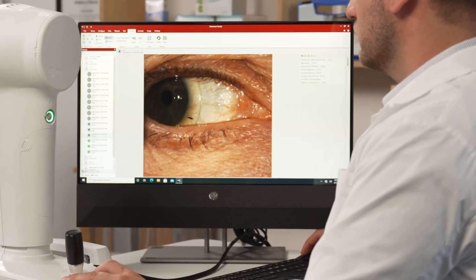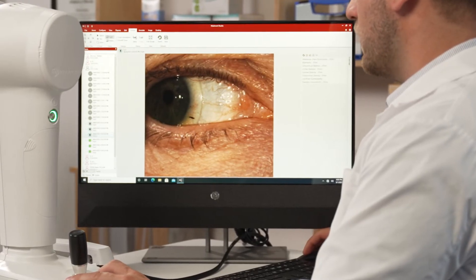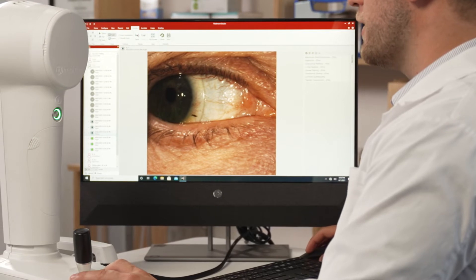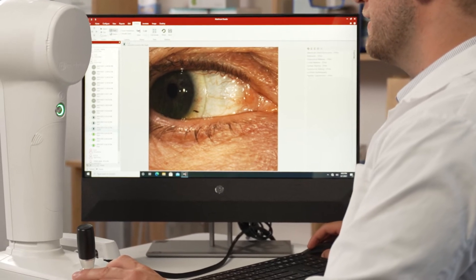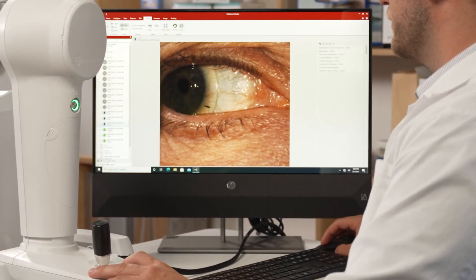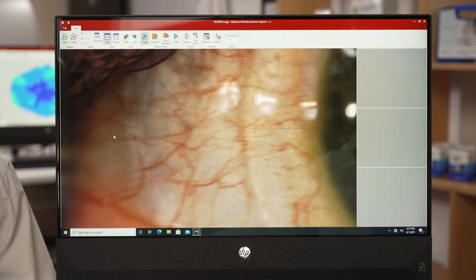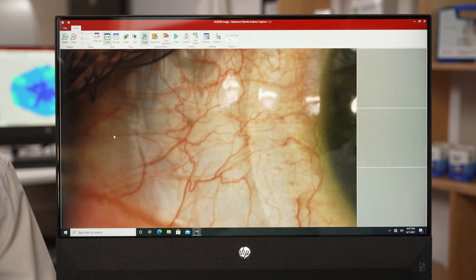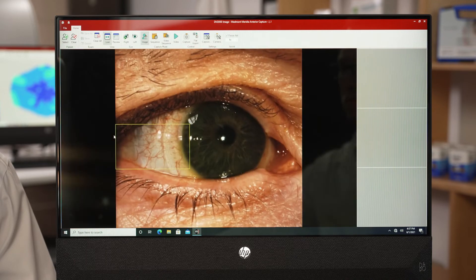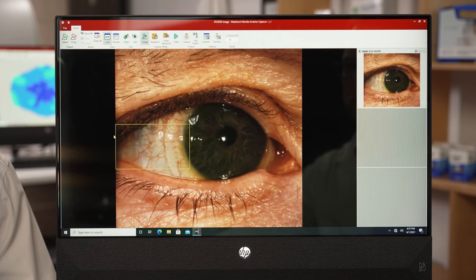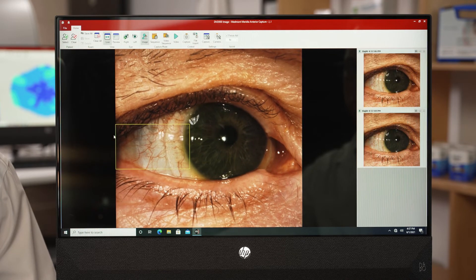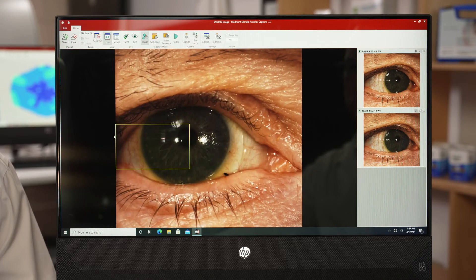The instrument is also able to take anterior segment white light imaging. This can be an important way to document findings from each of your visits. Additionally, these images and video can be shared with your contact lens lab consultant to optimize fits in complex cases.